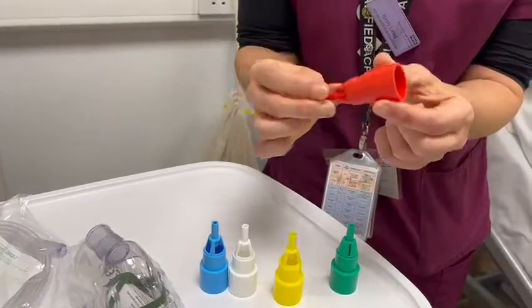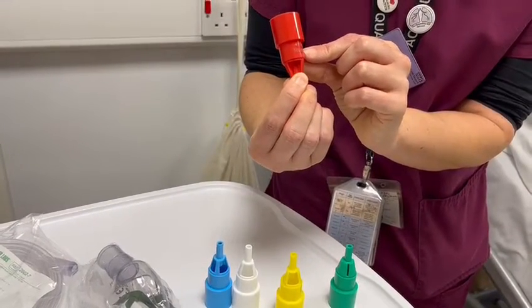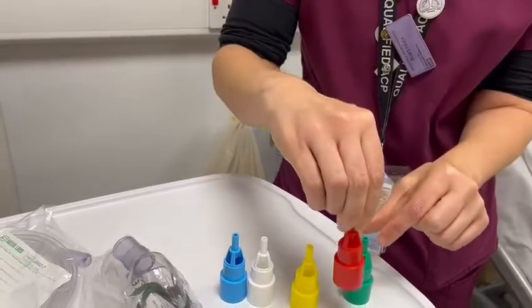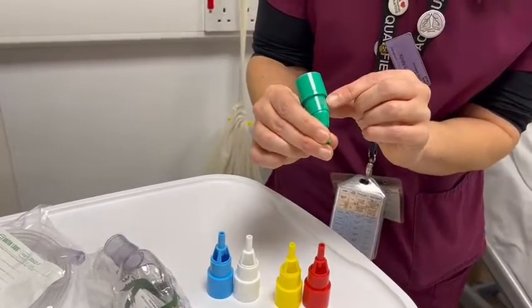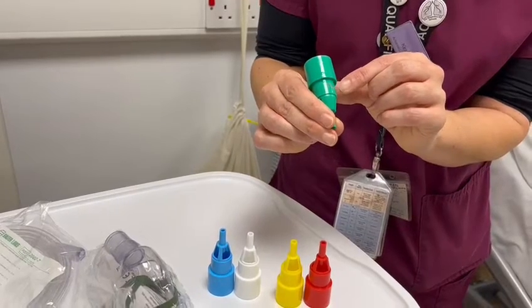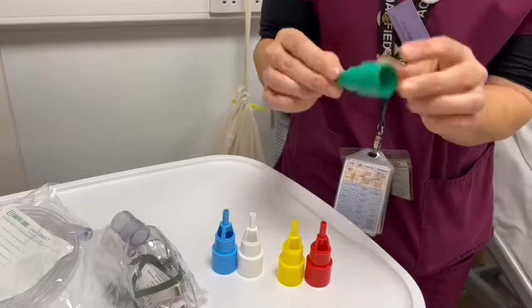It then steps up to the red one, and this is our 40%, which needs 10 litres in order to be able to deliver 40%. And then finally, our last one is our 60%, which needs 15 litres minimum in order to deliver 60%.